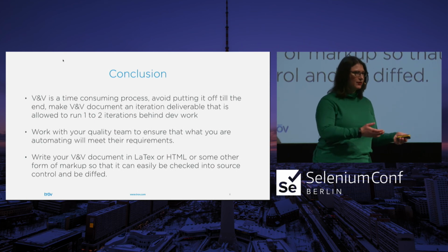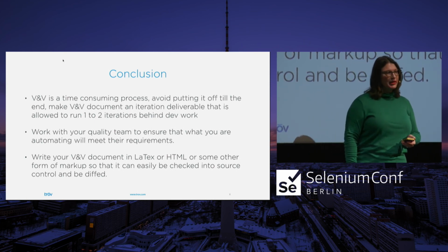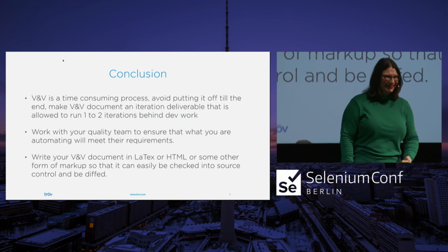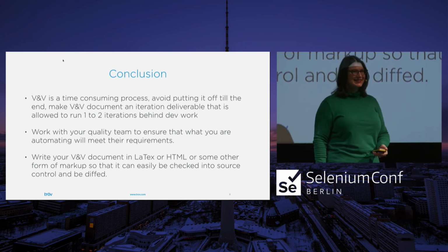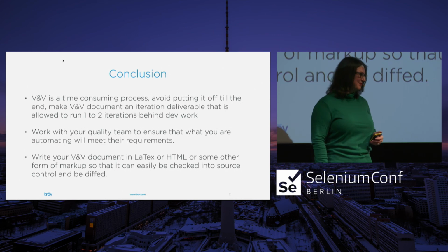So when you ship off your V&V, you're going to say, I developed it according to my quality management system. And then you're going to send them your quality management system. So you're going to send them a giant box of stuff. It's going to be an inbox, because quality management systems are hundreds to thousands of pages.